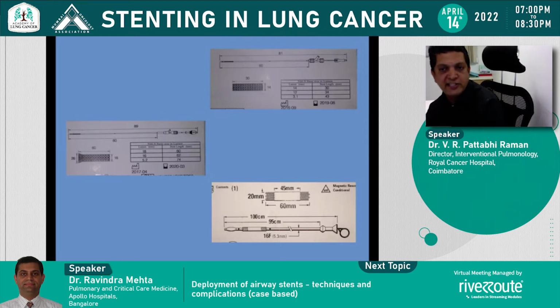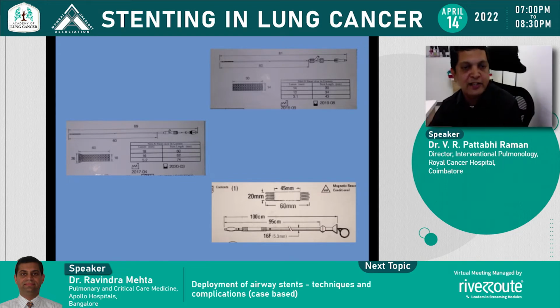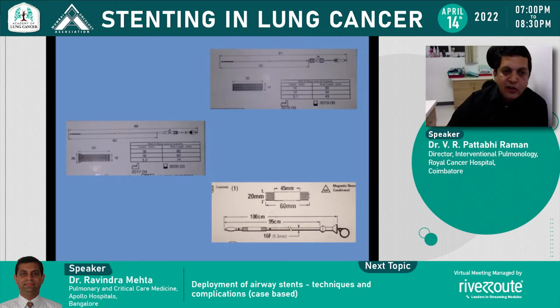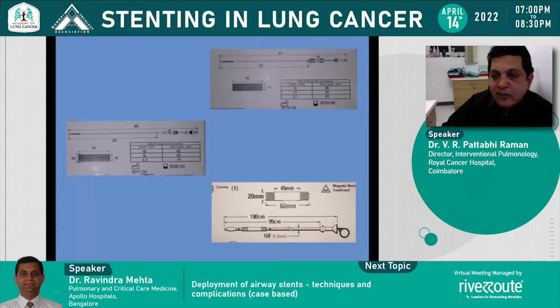Typically, when you put in a stent, you have to ensure that at least 1 centimeter on either side of the pathology is covered, so that the waist of the stent should have an area above and an area below which is normal, so that the stent is straddling on both sides. You also have the diameter of the stent deployer and all that. These are very important to know what conduit you're going to use and how it is going to go in. Next, please.